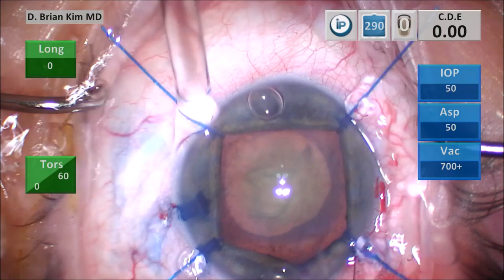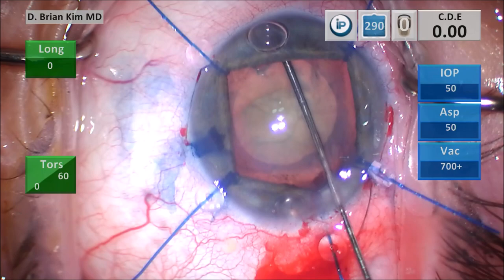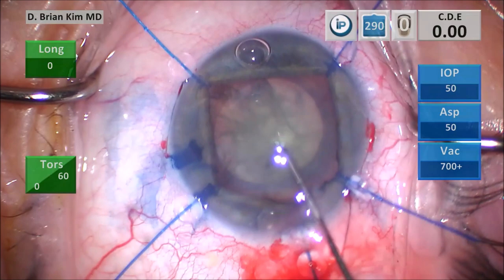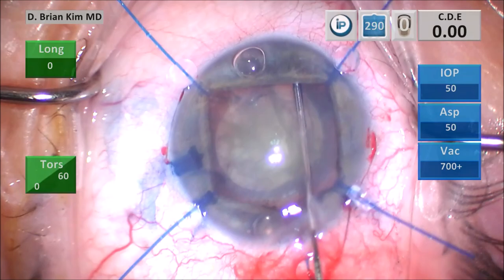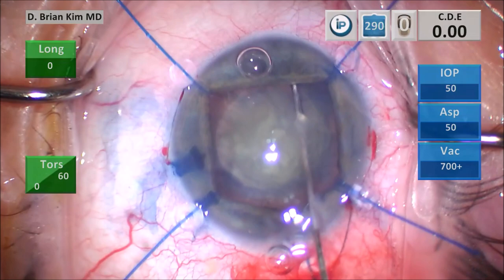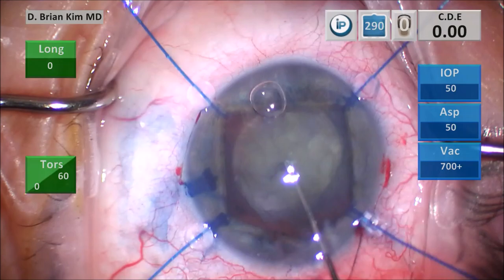I'm going to the capsular fornix hydrodissection technique. I place the cannula out to the contralateral equator, turn it down into the capsular fornix, get a nice wave, decompressing on the left side — freeing up the anterior capsular rim from the lens, first on the left and then the right. I have a healthy respect for the zonules in these situations: previous surgery, inflammation with posterior synechiae — these zonules I just don't trust. So I'm being very gentle, not creating too much force on the lens capsule.